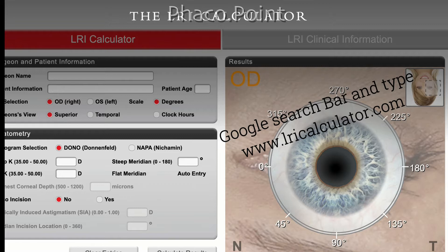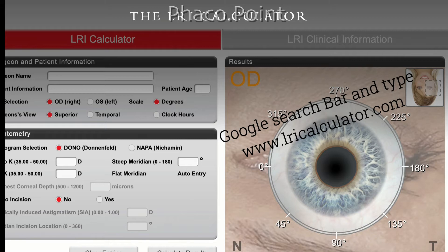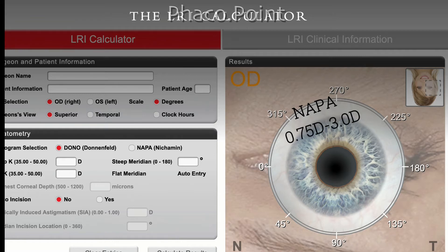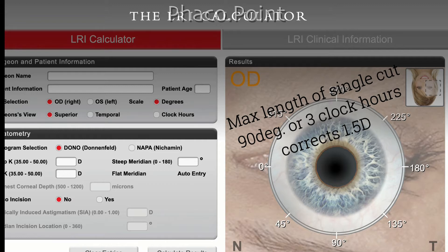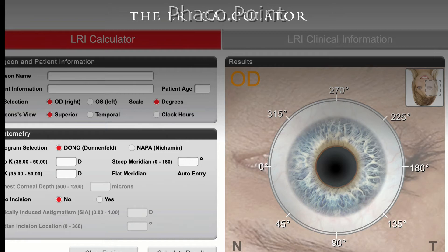After entering the patient details, you can choose between the Donnenfeld or the Nichamin Nomogram, enter the relevant details about the patient's astigmatism, and the correction will be displayed in degrees or clock hours. The Nichamin Nomogram corrects from 0.75 diopters to 3 diopters, while the Donnenfeld Nomogram corrects from 0.5 diopters to 3 diopters — so if you want to correct astigmatism less than 0.75 diopters, use the Donnenfeld Nomogram. In both nomograms the maximum length of cut allowed is 90 degrees or 3 clock hours, which will correct about 1.5 diopters of astigmatism.